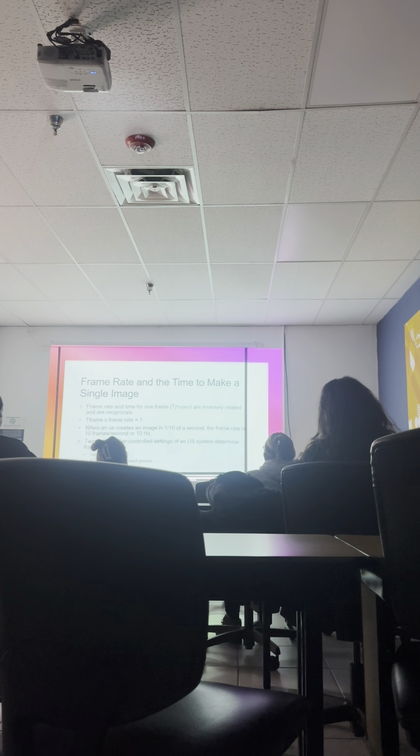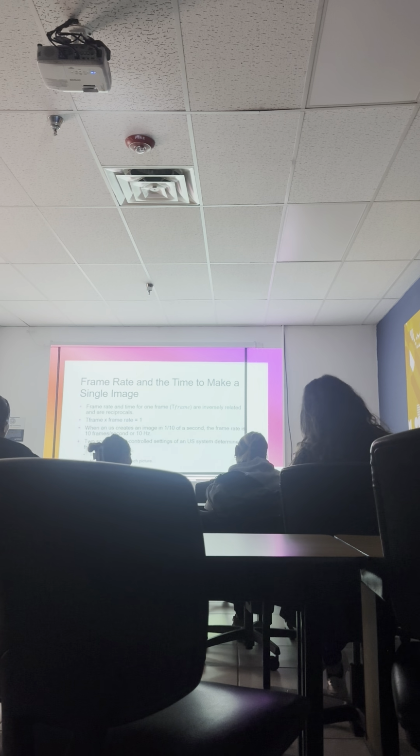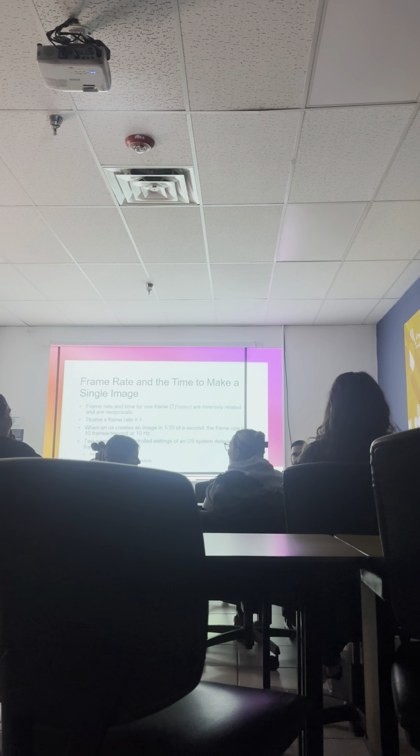Okay, now, number of pulses in each picture. How do you think the pulses influence the image? No, the number of pulses, not how long they are. Well, the more pulses, the better the resolution. Okay, that's correct. I was going to say the number of pulses, it takes longer.